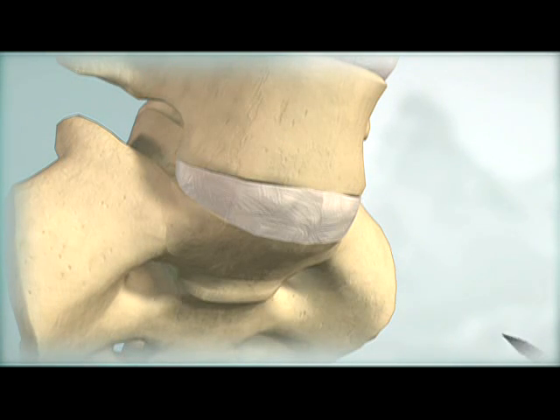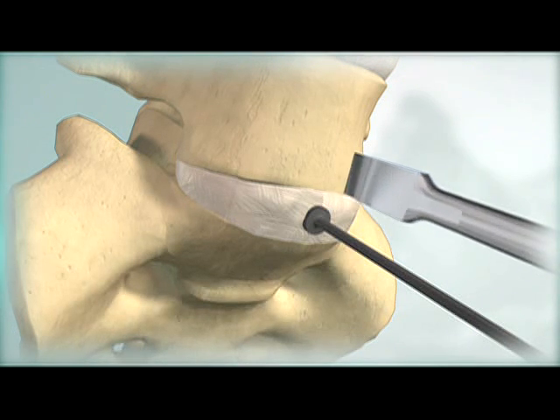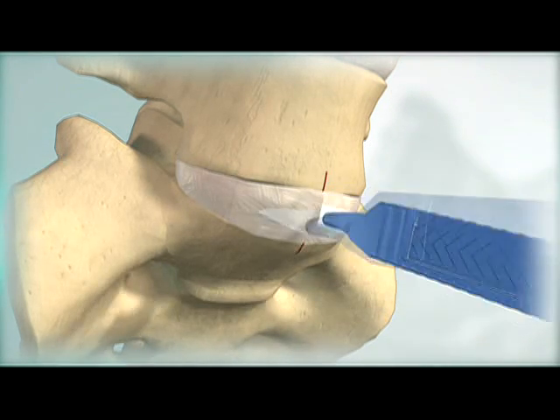Identify and mark midline on the superior and inferior vertebral bodies adjacent to the operative level. Create an annulotomy centered on midline wide enough to accommodate the ProDisc-L Implant.